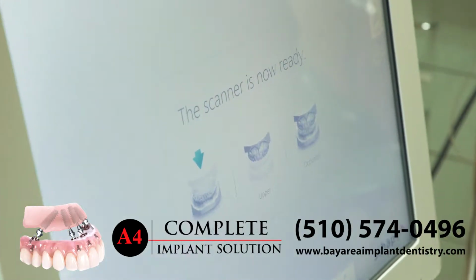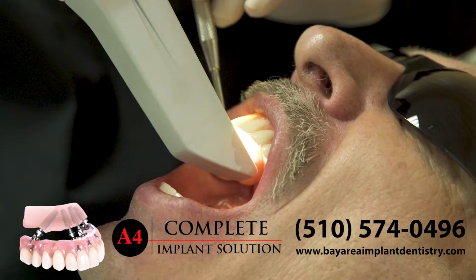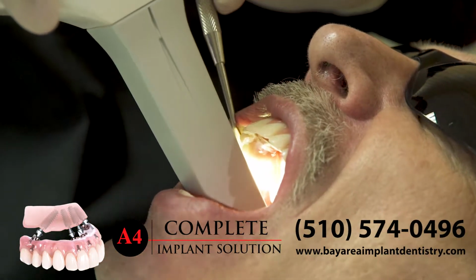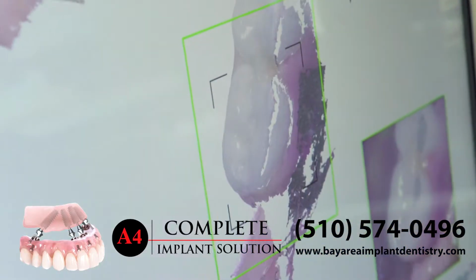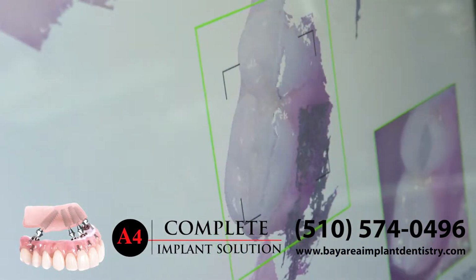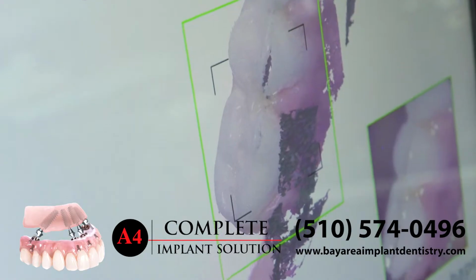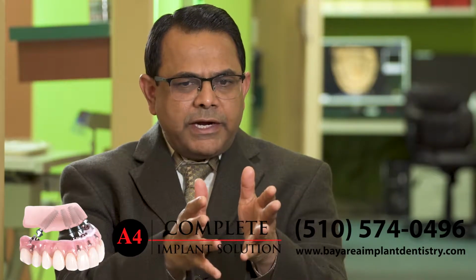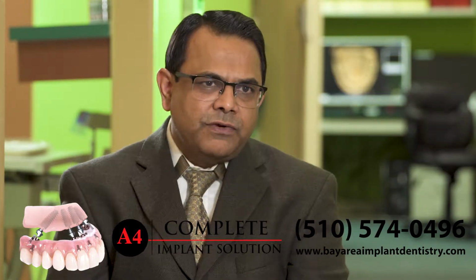Here we have Trios. It's an intraoral scanner. It's a light that's shed on the teeth, and it takes thousands of pictures, and those pictures are stitched together to make a 3D model of the inside of the mouth, the teeth, implants. And that data, when it's acquired, is sent to our designing software.